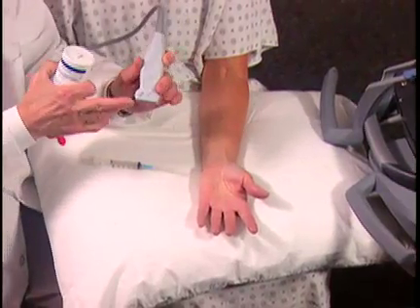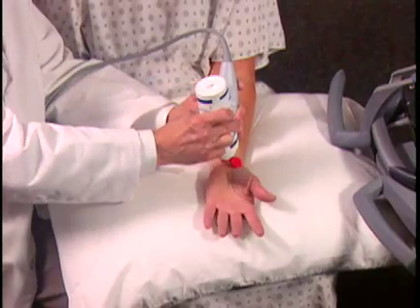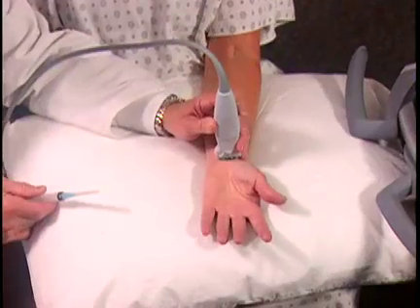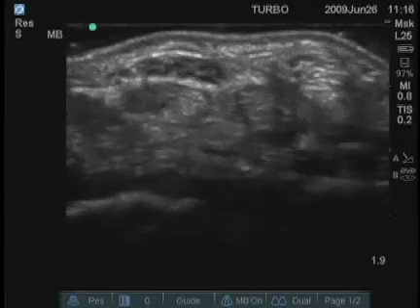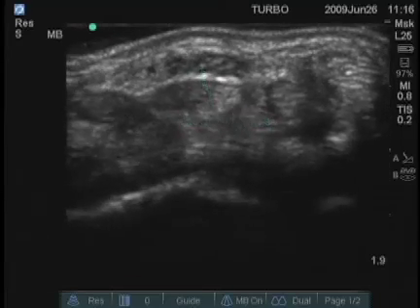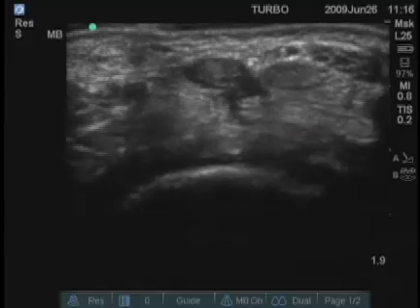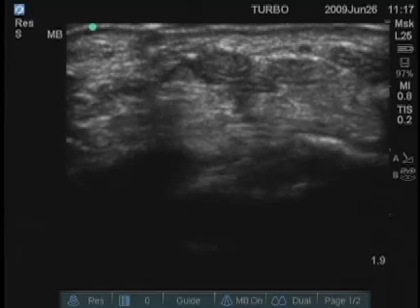Again, I'm going to be placing the needle parallel to the transducer. Apply some gel here. By placing the transducer transversely, I have in the middle of the screen the median nerve. I can find the ulnar artery on this side, and you can see it pulsating.